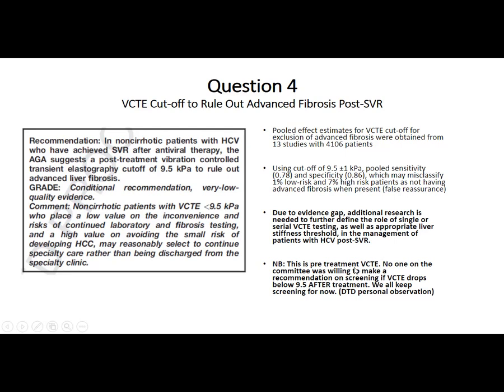Now, you can see the two bolded bullets here. There's an evidence gap. Additional research is needed to further define the role of single or serial elastography testing, as well as the appropriate liver stiffness threshold in the management post-SVR. So my note here is this is a really important point, and I don't think any one of us knows the answer to this one yet.